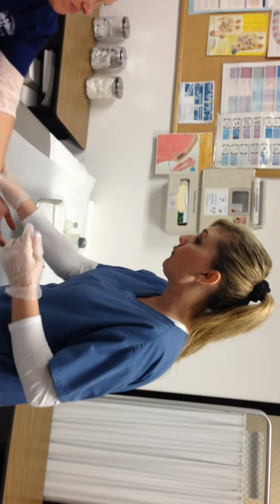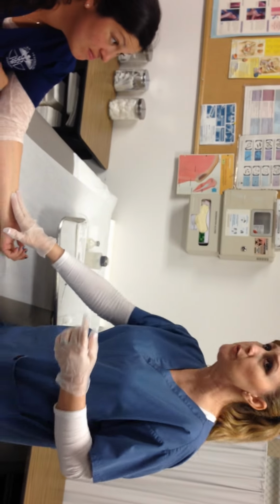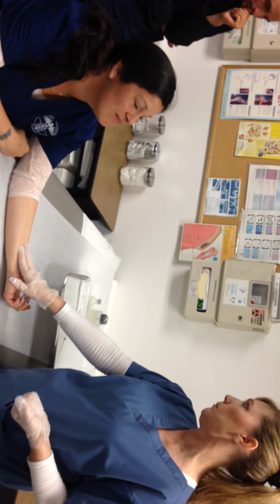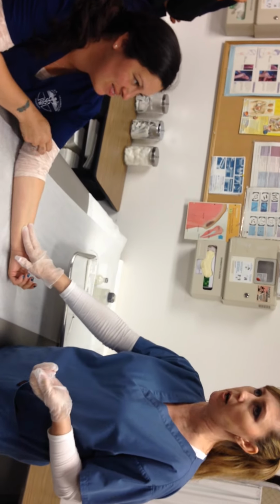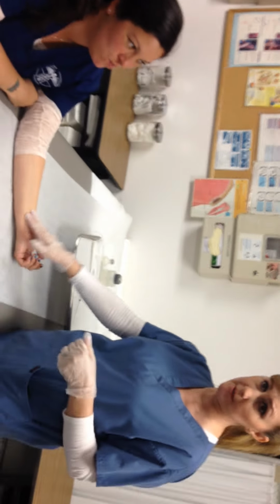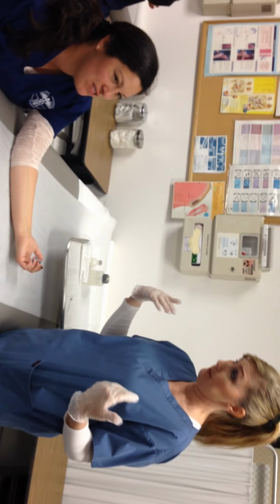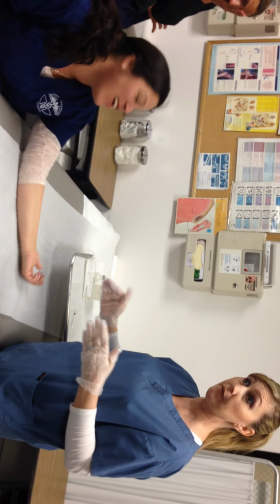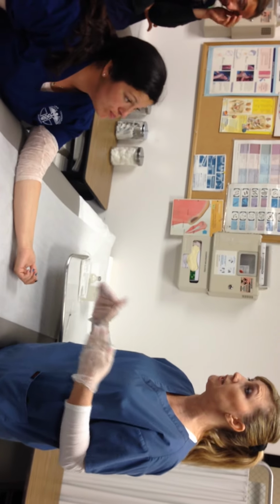So I need your forearm here. Which arm do we use? Well, it depends on your office. Some offices will say always the left arm. Some offices will say always the right arm. Well, what if they don't have a left or right arm? Same thing with blood pressure, right? I just do it on whichever one they give you. Yeah, and some will just be like whatever. But some offices are very strict. Only the left arm. Why?